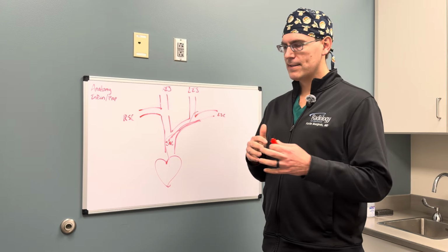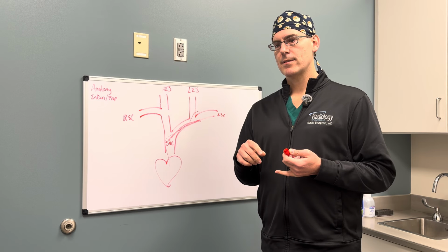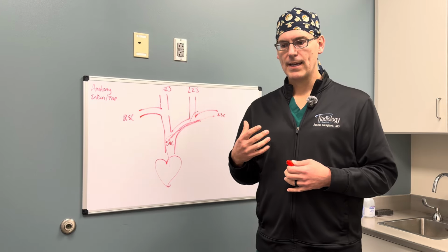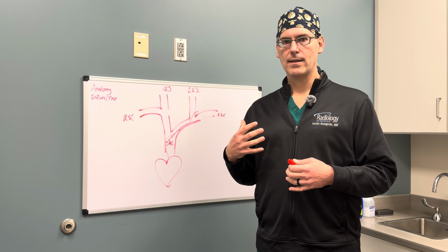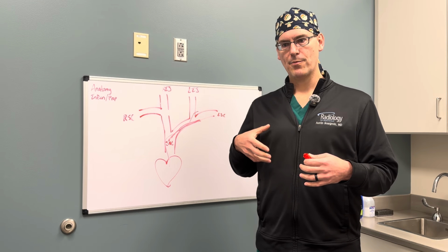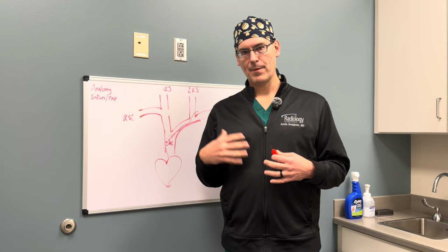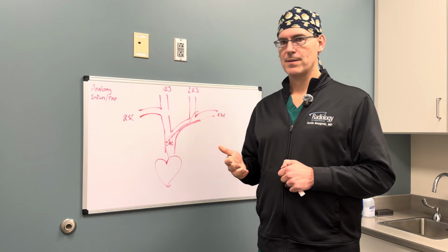A couple of things that we do here: we give Ancef, or an antibiotic, that covers gram-positives, or bacteria that could be on the skin. The way that we prep ports is also really important. We ask that at least from the nipple line to the ear be fully prepped in the site where we're placing the port. There should be at least 6 inches of prep on either side of the access site. It's best to completely remove the patient's gown from their chest for the port procedure. If it's just underneath the sticky portion, then there's a possibility for contamination, which is a big deal.